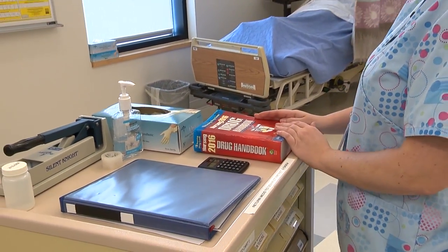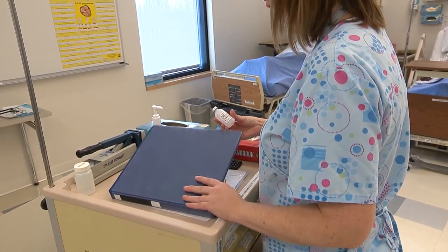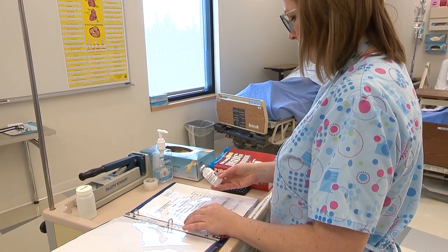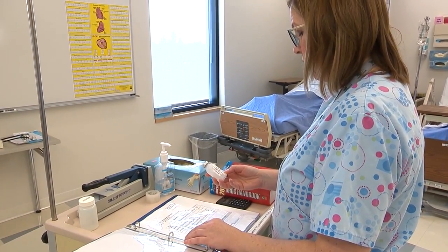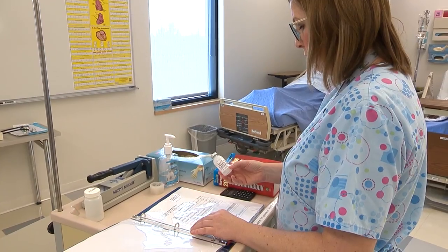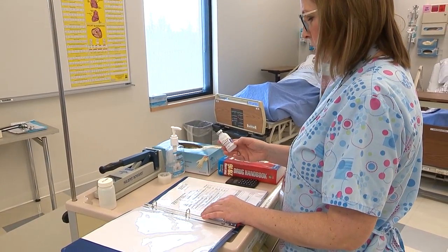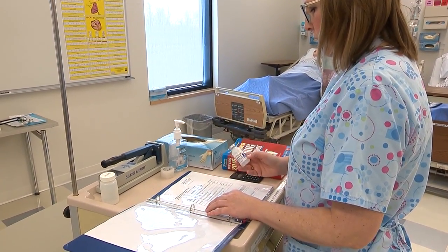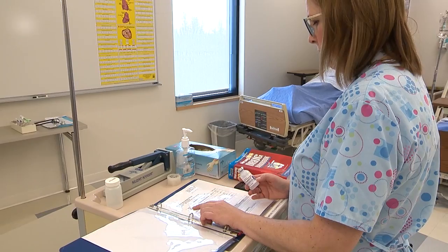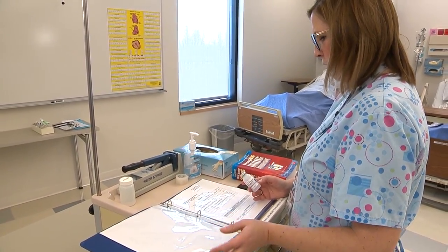Now I'm going to prepare my medication. I have morphine sulfate injection, 2 milligrams per ml, with an expiration date of 12-20-50 — so that's good. I'm to give a dose of 2 milligrams, so since this says 2 milligrams per ml, I'm only going to draw up 1 milliliter. The date is today, the time is now, for Morgan Brown, date of birth 8-4-70, with no known allergies. I will complete my documentation after I've administered the medication.